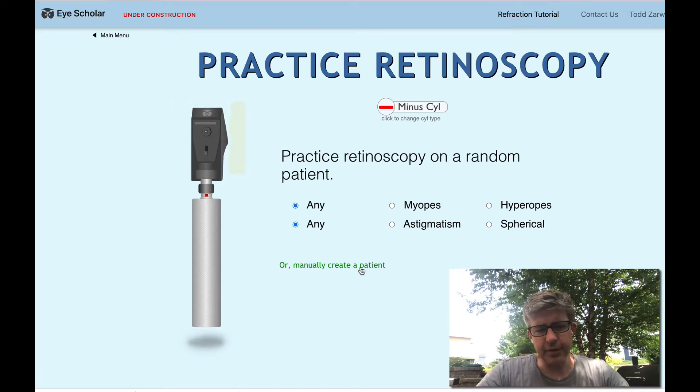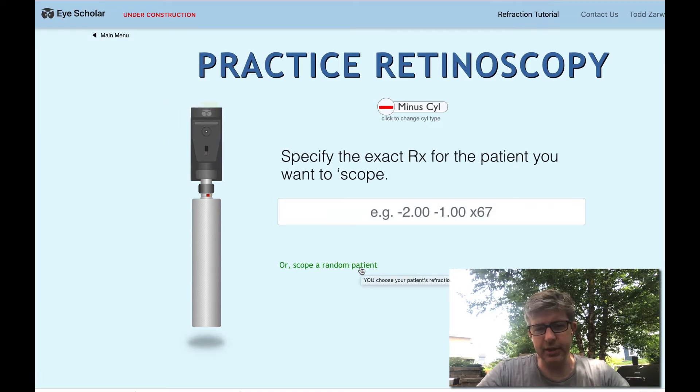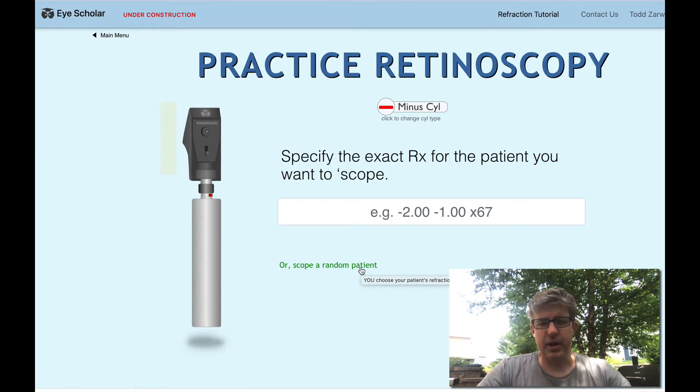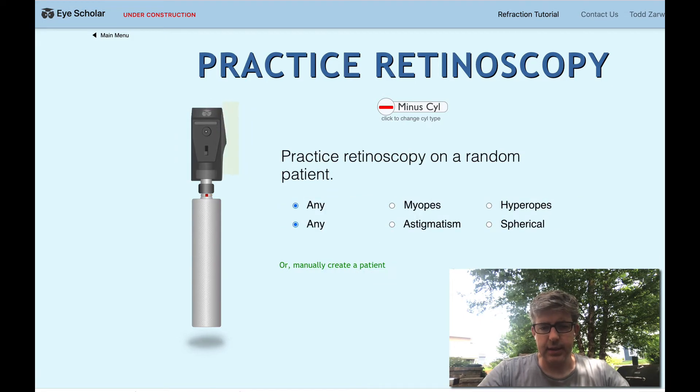You also have the option of just manually creating a patient. So you can say I want to scope a minus seven minus four axis 93 and that's the patient you'll get. You won't be surprised at the outcome but it'll give a chance to practice on something specific if you want to. But let's just do a random patient.